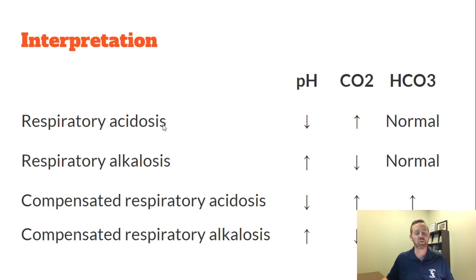So if you have a pure respiratory acidosis, what you're going to do next, from looking at the pH to determine if it's acidotic or alkalytic, is you're going to look at the CO2 and the HCO3 in combination. You can't really assess these independently because it'll be hard to make sense of what's going on. But in a pure respiratory acidosis, where the metabolic side has not attempted really to compensate for what's going on with the CO2, you'll have a low pH and an elevated CO2, right?